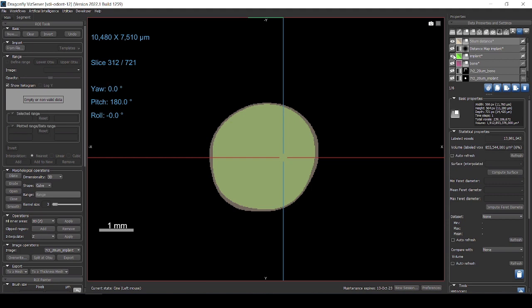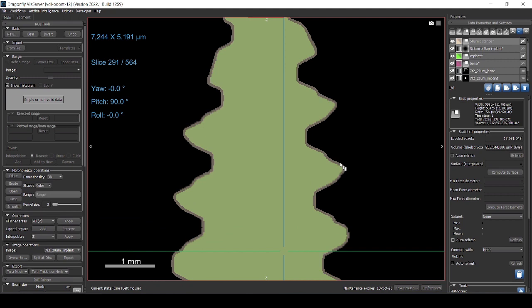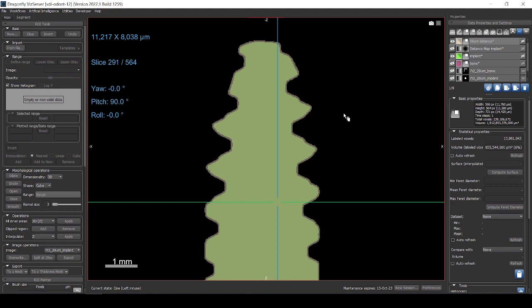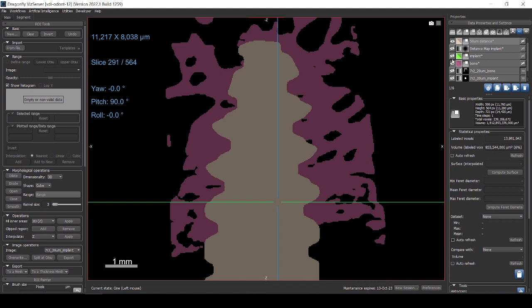Let's get rid of this view here. So you have the implant here, it looks like it's not really 50, but you have to remember, we are working in the 3D view. So that is basically the distance. If you look here, you can clearly see that it's very homogeneous, a distance from the implant. So this is only giving me the distance from the metal, from the implant. What I want to see actually is how much bone is within this area.